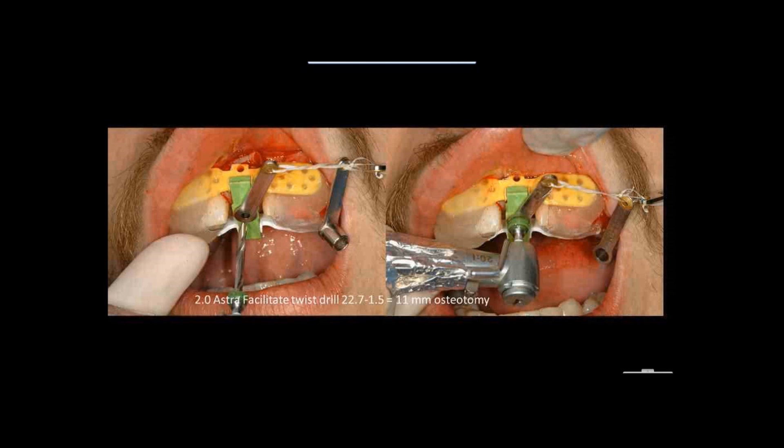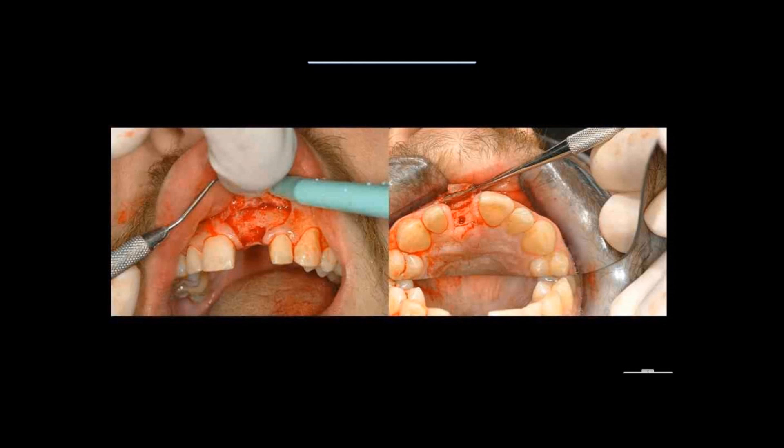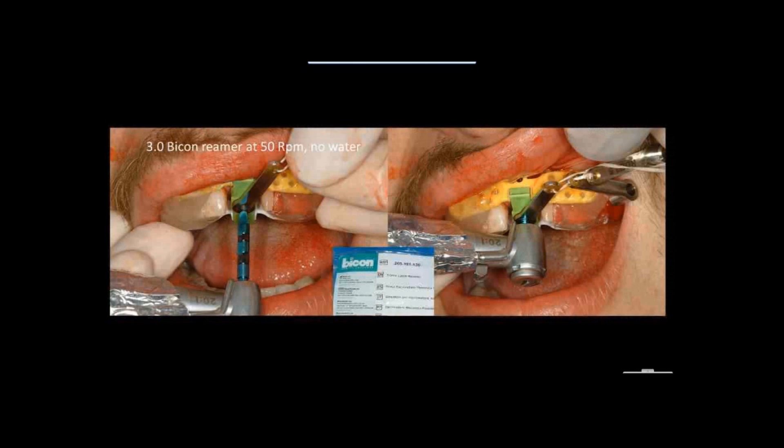We have a 2-millimeter osteotomy. Now I'm moving to a drill from Bicon — a latch reamer, which is from a different implant company. I'm going to use a 3-millimeter latch reamer at 50 RPMs with no water to increase the diameter of the osteotomy.